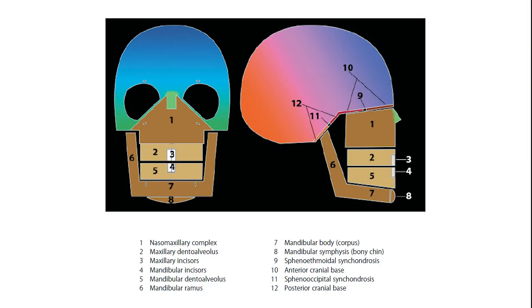So, it is very important to understand the geometric principles required to fully appreciate cephalometric analysis, bearing in mind that the clinical evaluation always takes precedence over cephalometric analysis. Ideally, cephalometric analysis will follow, corroborate, and add to the clinical evaluation.